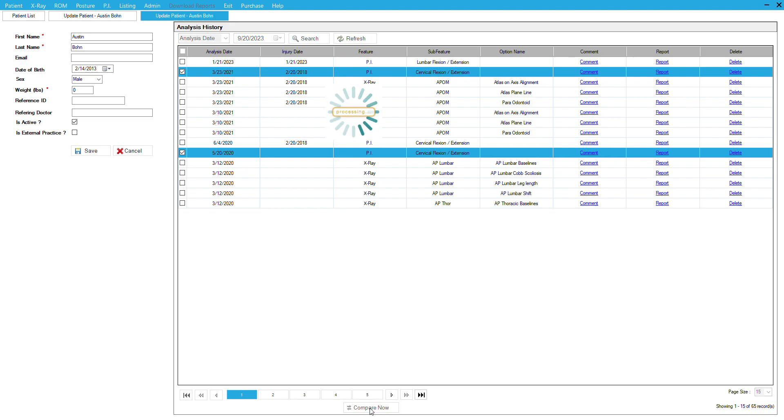The software will generate the images. Here's the flexion extension and the flexion extension. I've put some comments in here already, but you could type whatever you want.